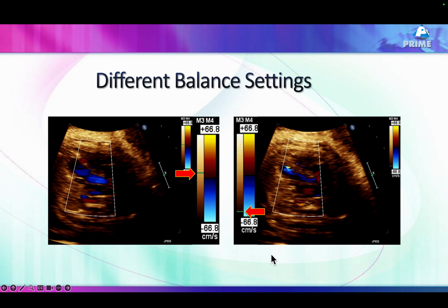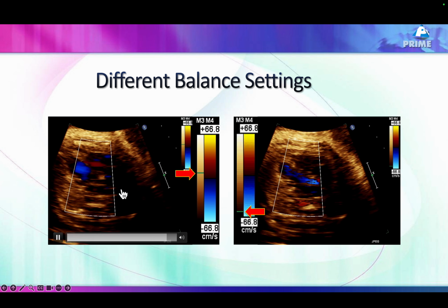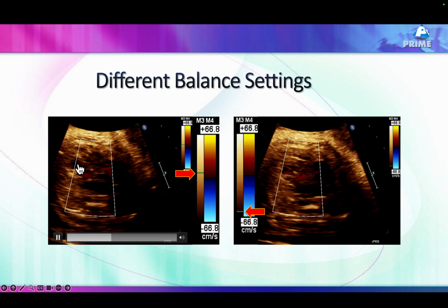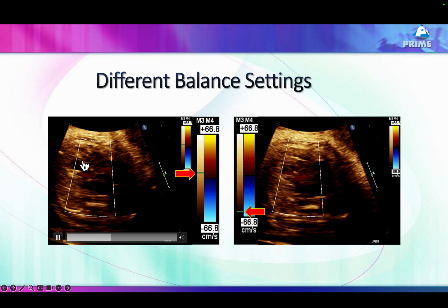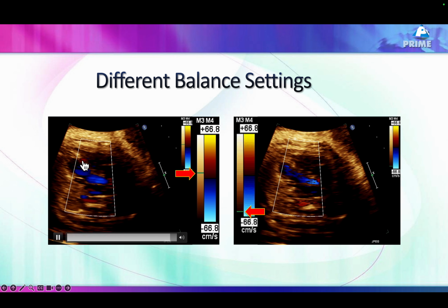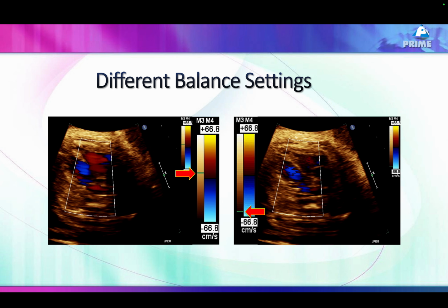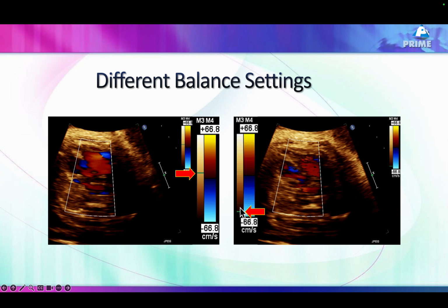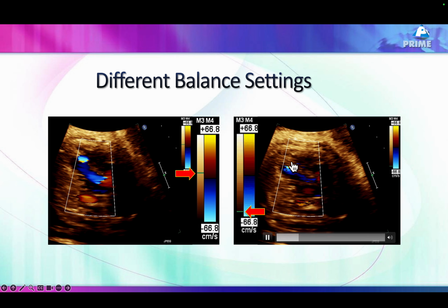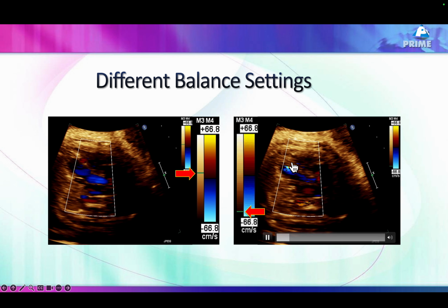Another example. That's a patient with a ventricular septal defect on a fetal echo. This is about 18 weeks of gestation. And you see this is a mid-muscular VSD with a color Doppler flow across it. And this is the priority given to the 2D. We are not giving much priority to 2D. But if you start giving more priority to the 2D, the 2D information is overwriting the color Doppler.